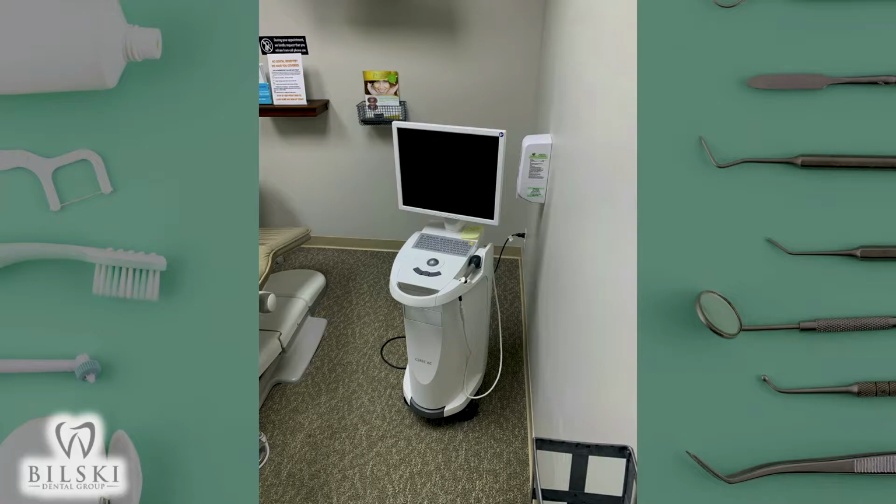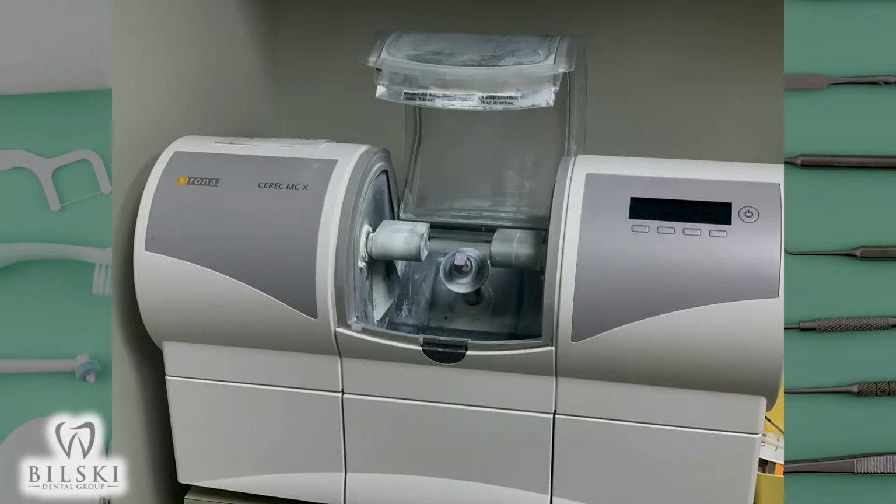Shape the tooth the way we need it to be shaped. Then we take a picture. And then it gets sent over to the milling unit. So what we have is like a lathe. It's called a 3-axis CNC machine, which is used in a lot of businesses. And we've brought it into our practice and been using it well over 20, 25 years.